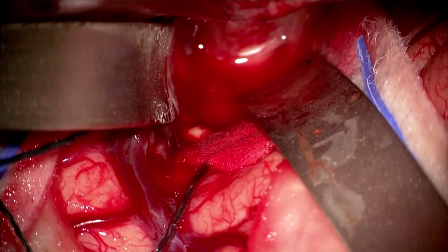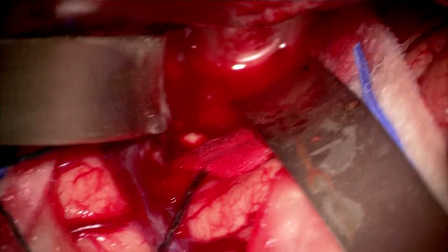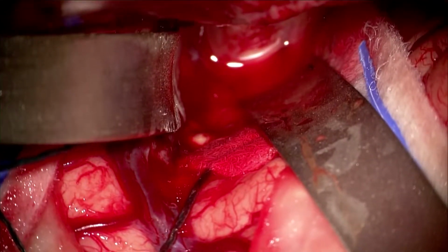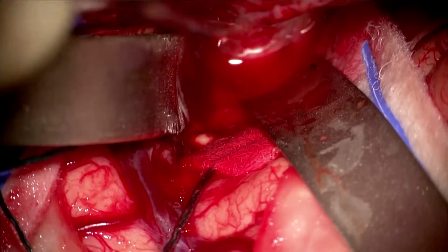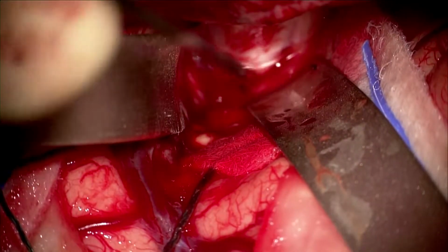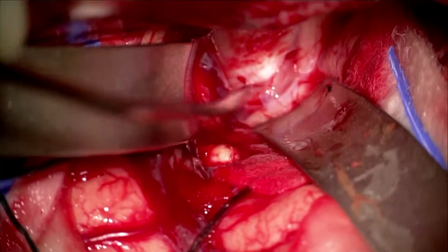A second retractor blade is being applied now to the temporal lobe. And with that retractor in place, between the two retractors, you can see a very bright white circle right beneath my sucker now. And that is likely the dome of the aneurysm, which now is a little bit more in view.